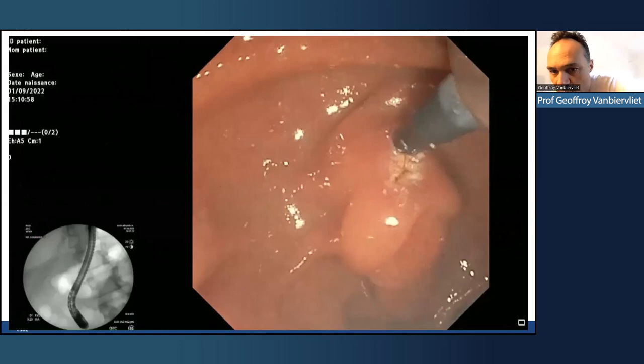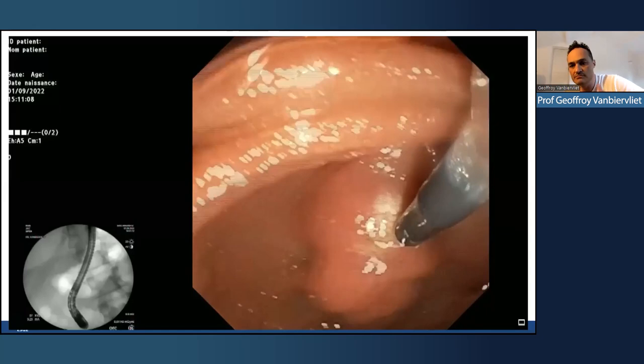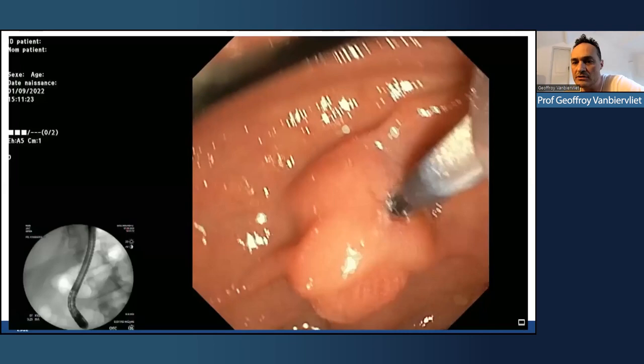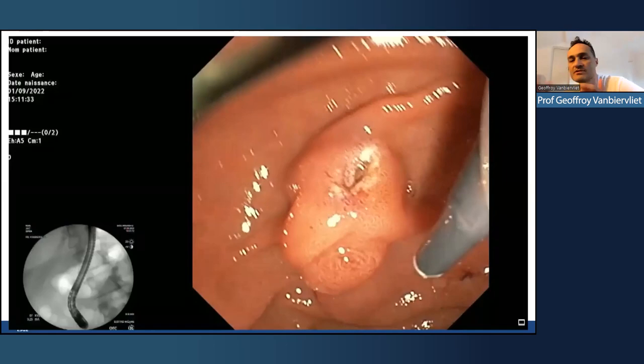And me, I prefer to be very step by step. I want just to cut the mucosa layer, then to expose the sphincter, and then if I need, to put another impact of coagulation to introduce my guide wire inside the sphincter. I think it is a good way because if you do a large cut during the first impact, the risk is to induce a large and huge bleeding. And when there is a bleeding in this situation, it is impossible to introduce your guide wire.